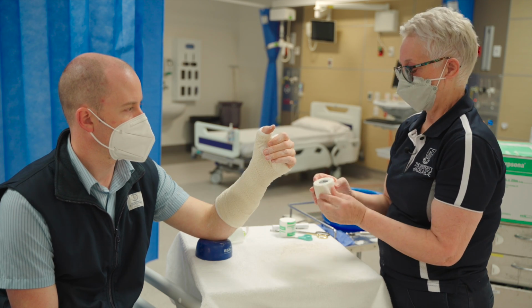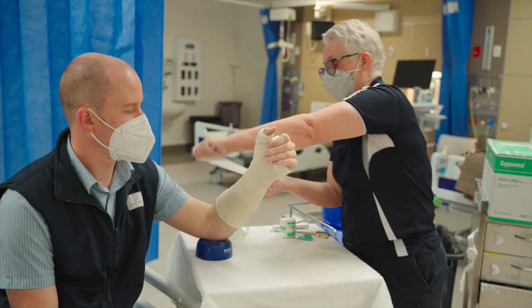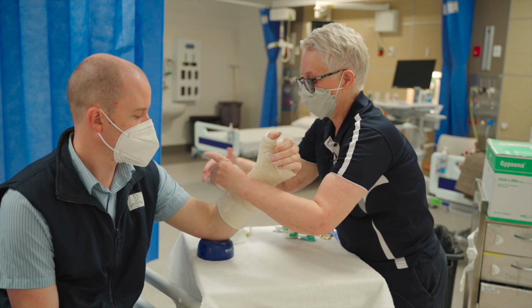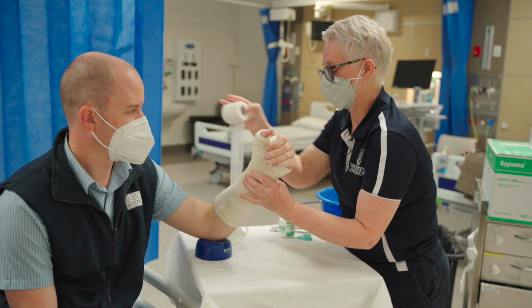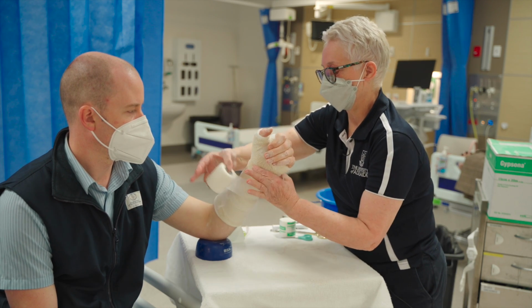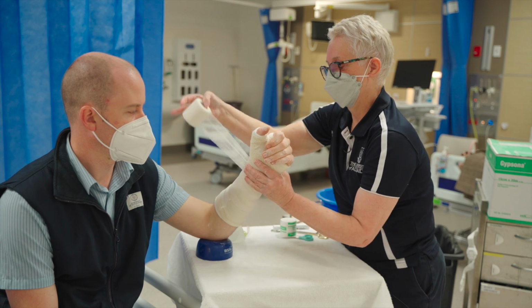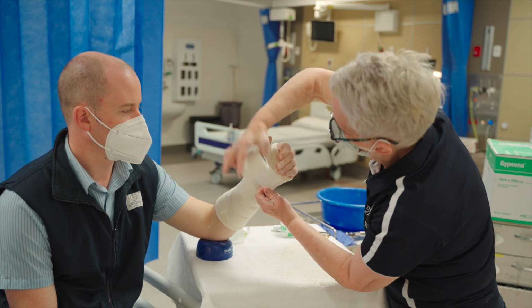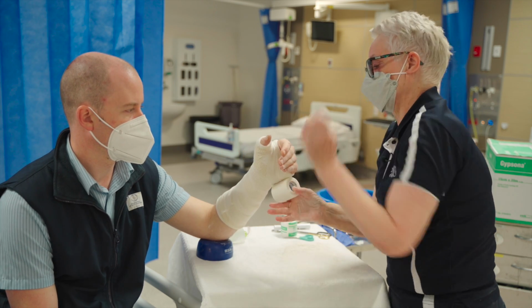And you can use 2 layers of the crepe bandage if you wish, but we find that this easy cohesive bandage is actually a lot better. It keeps the splint in place, keeps the bandage nice. As usually within about 24-48 hours, this bandage loses its elasticity and the cast becomes loose. So we just pop that on, and this is just pulled out at a loose tension and laid down. Don't pull it too tight because it has elastic in it.